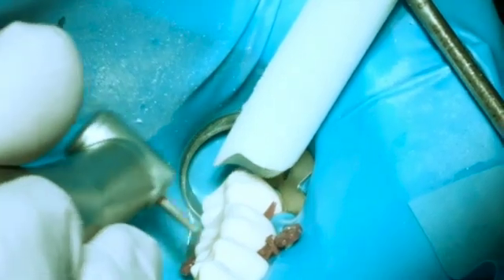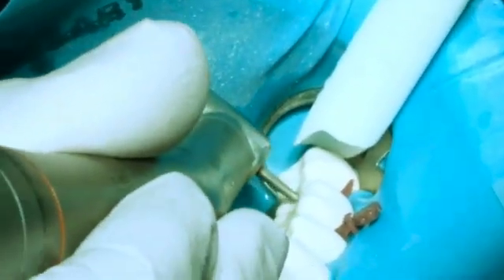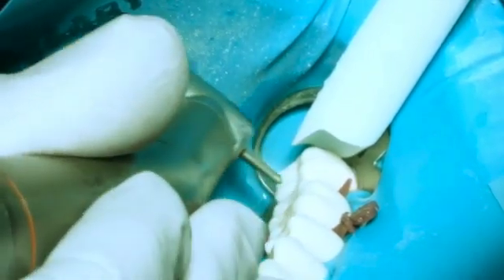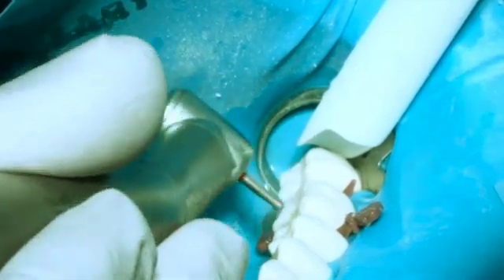To define, redefine, deepen, do whatever I have to do — put secondary anatomy in. It's the same angles as the other two larger acorns. You can also use it for fissurotomies or for box preps. It works beautifully for pit teeth. And again, limit stop and safe edge — you cannot scar the enamel with this.